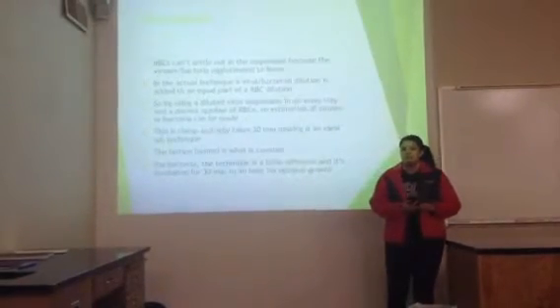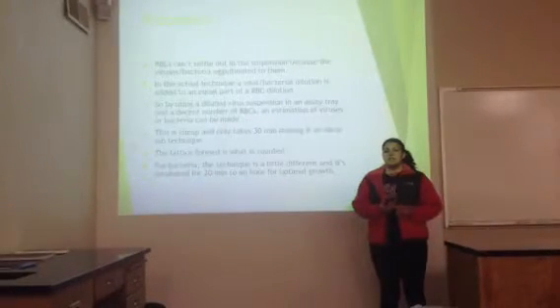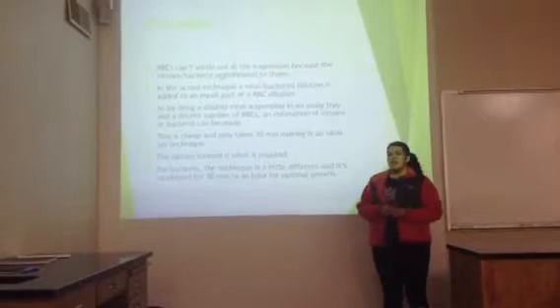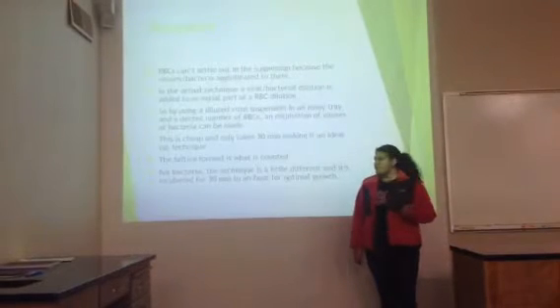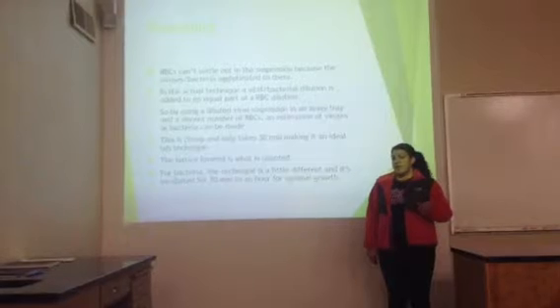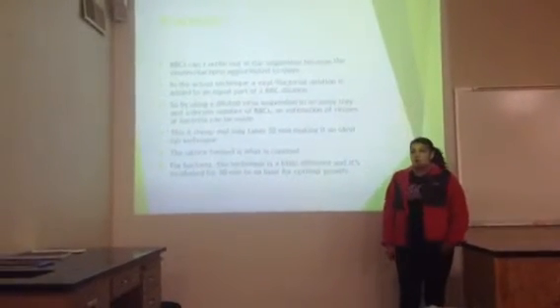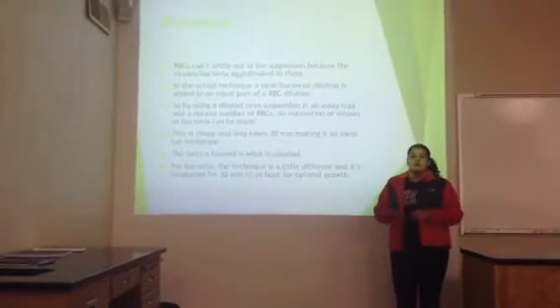It's cheap, it only takes 30 minutes, and it's an ideal lab technique, like I said. The lattice is what's counted. So, like I showed in the previous slide, if there's darkening, you can tell there's a presence of viruses or bacteria. But for bacteria, the technique is a little different. You would put it in an incubator for 30 minutes to an hour for optimal growth of the bacteria to see if there are bacteria present.